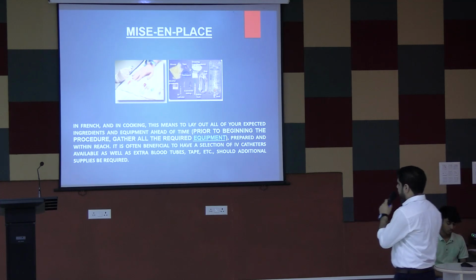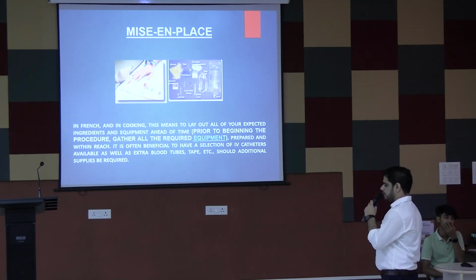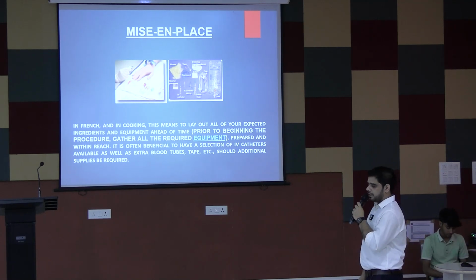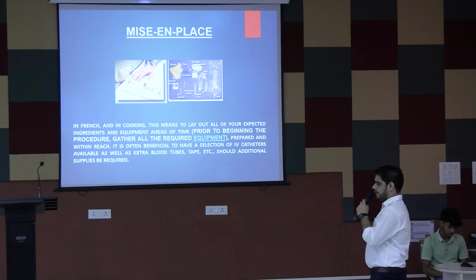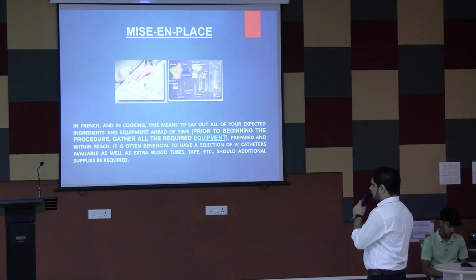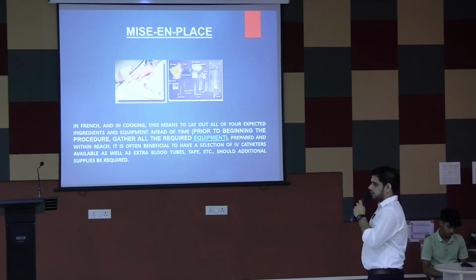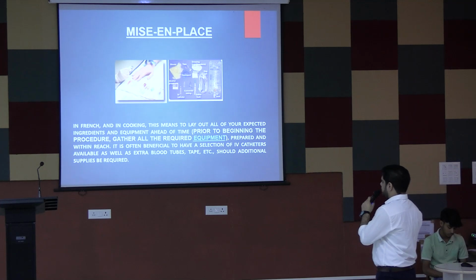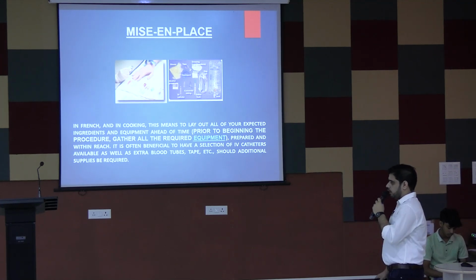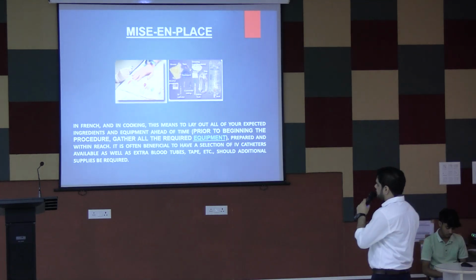Mise en place: prior to beginning the procedure, gathering all the required equipment should be done first, because during difficult IV access it is very mandatory and required, because during difficult IV cannulation, much bleeding and extravenous cannulation may occur, so all the equipment should be gathered first. So this is called mise en place.